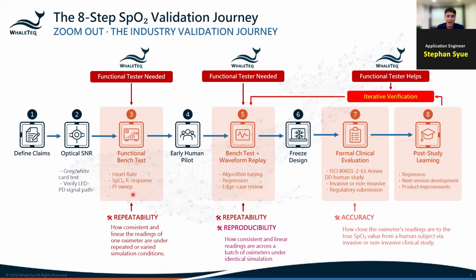And then number 4, we have a pilot study, not for clinical accuracy. It's for everything else: does the sensor actually stay on the wrist? Does motion artifact destroy the signal? Is the raw PPG quality good enough for SpO₂ calculation? That's where we get the real-world optical coupling data. This is the step where we really get out of the lab and into the world.